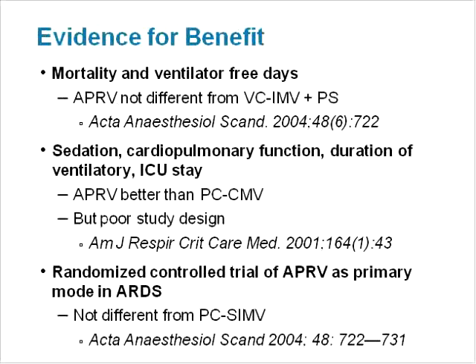Compensation for endotracheal tube resistance using pressure assist in proportion to the inspiratory flow may reduce the work of spontaneous breathing in selected patients without deteriorating gas exchange. There are no data supporting the use of higher levels of assistance for spontaneous breaths using pressure support.